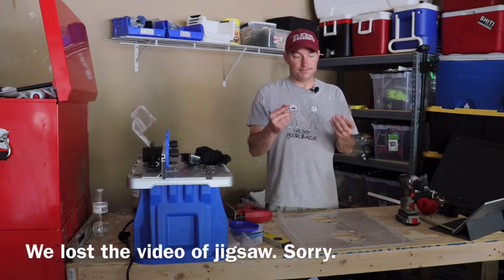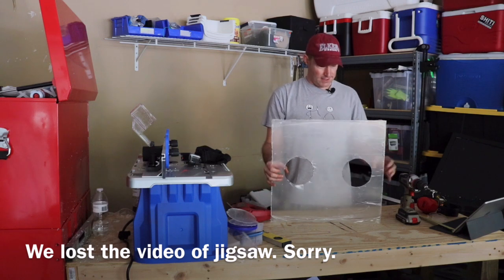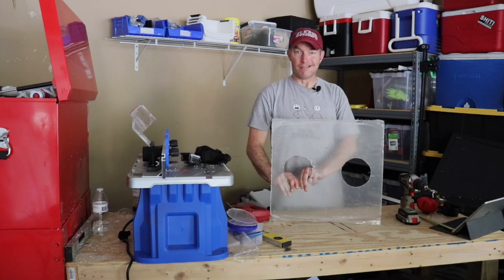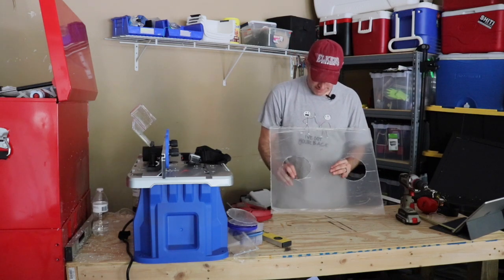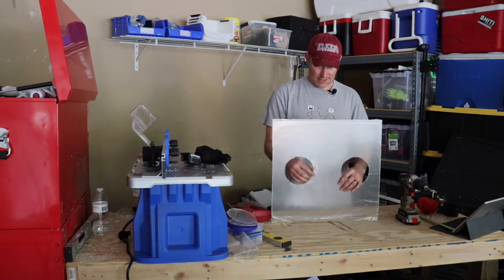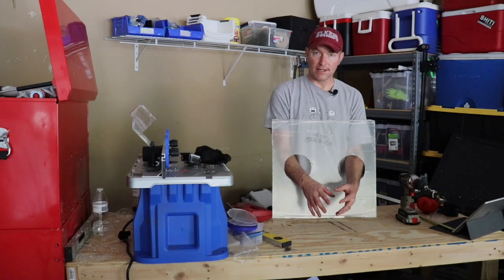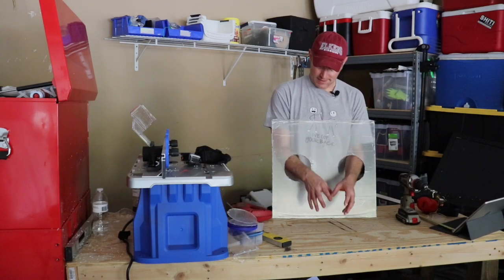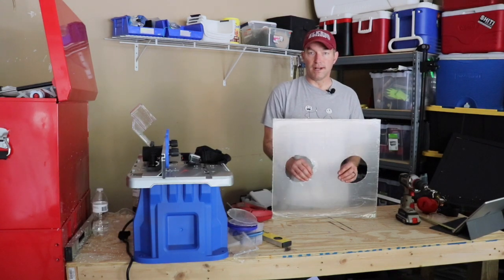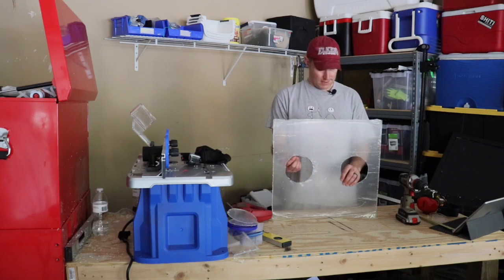All right, so as you can see, we got our circles cut out. Not the best technique. You see we got some cracks. Not what I was looking for. Not what I was hoping for. But hopefully we can correct that with some glue or something. Essentially this is going to be the back piece, or the front piece as they call it, and then you stick your hands through like this. I think that's okay. I'm not sure if my colleagues will like it, but when we take it to work we'll find out. So let's get these edges cleaned up right here and see what we can do with those.